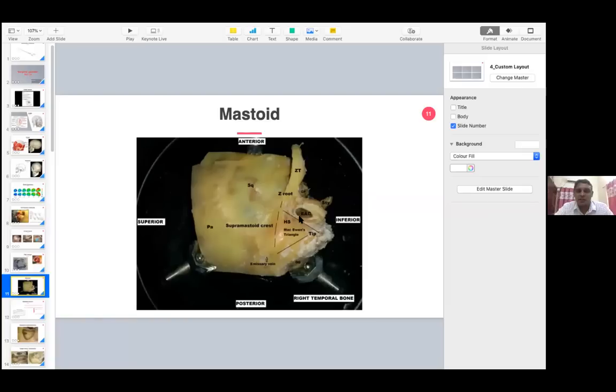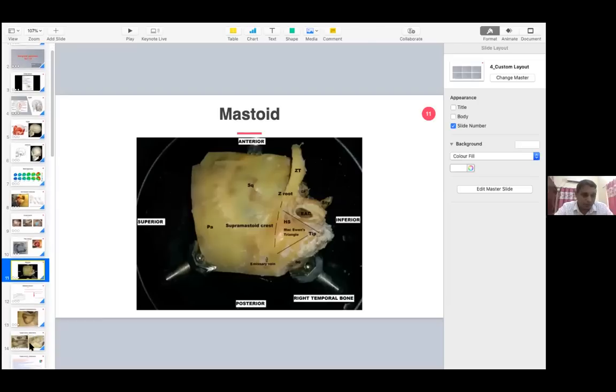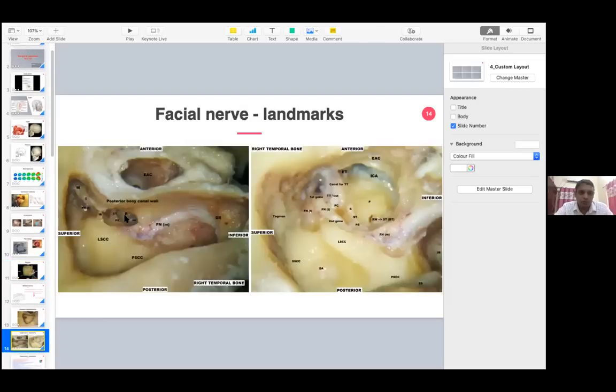So in the case of the Varia technique, you open the cochlea by drilling the cochlear lateral wall, that is bony cochleostomy, and enter the scala tympani of the basal turn. That is the same. Now, how to enter the middle ear is different. In a standard mastoidectomy, posterior tympanotomy route, we go by this route.